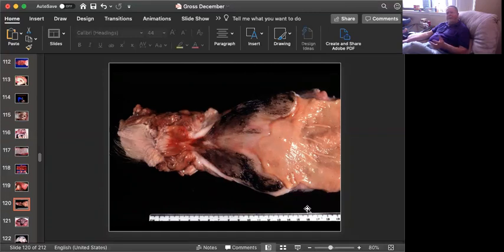Okay, time's up. I hope you stopped this a little bit and spent some time thinking about how this lesion comes to pass. We are looking at the rectum of a pig. A little bit of melanosis here, don't worry about that. And there is a rectal stricture.